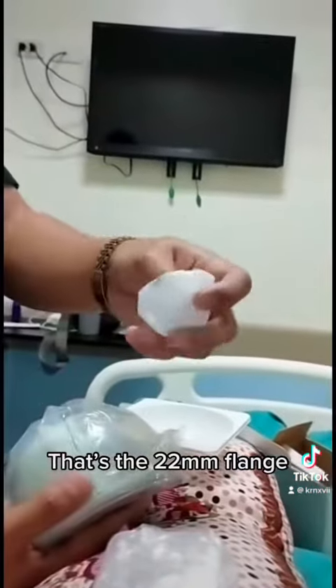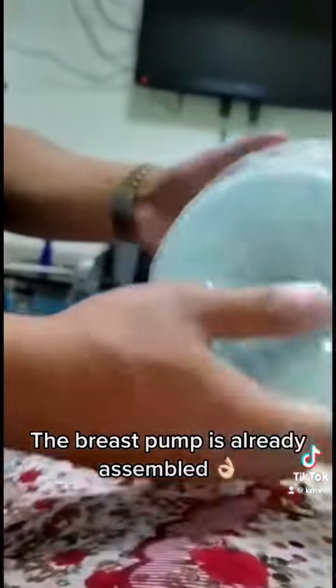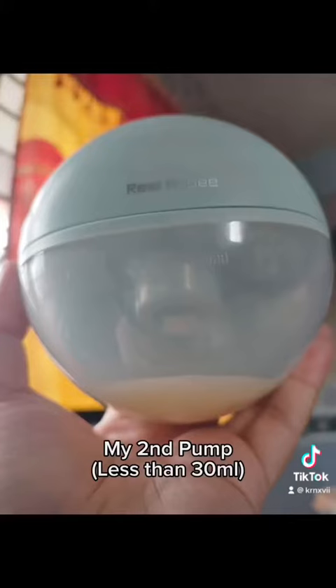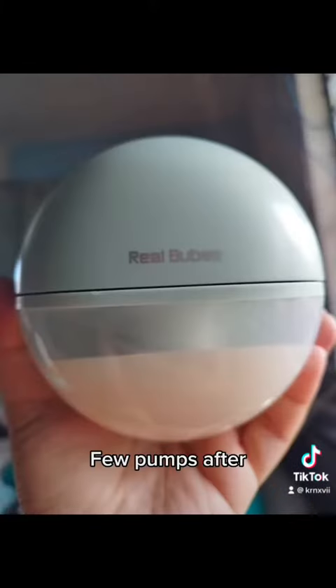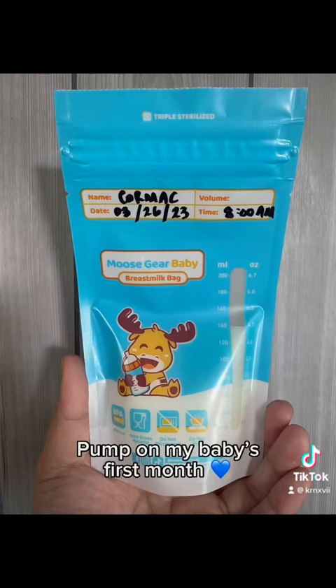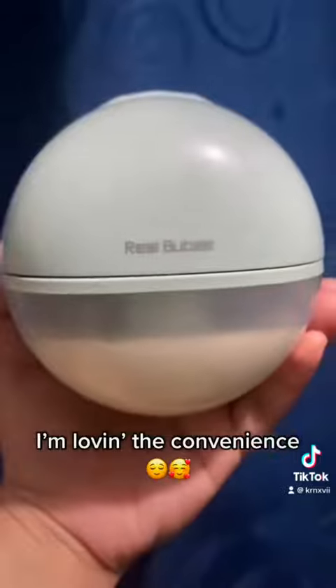That's the 22mm flange. The breast pump is already assembled. It also comes with a manual. I'm loving the convenience.